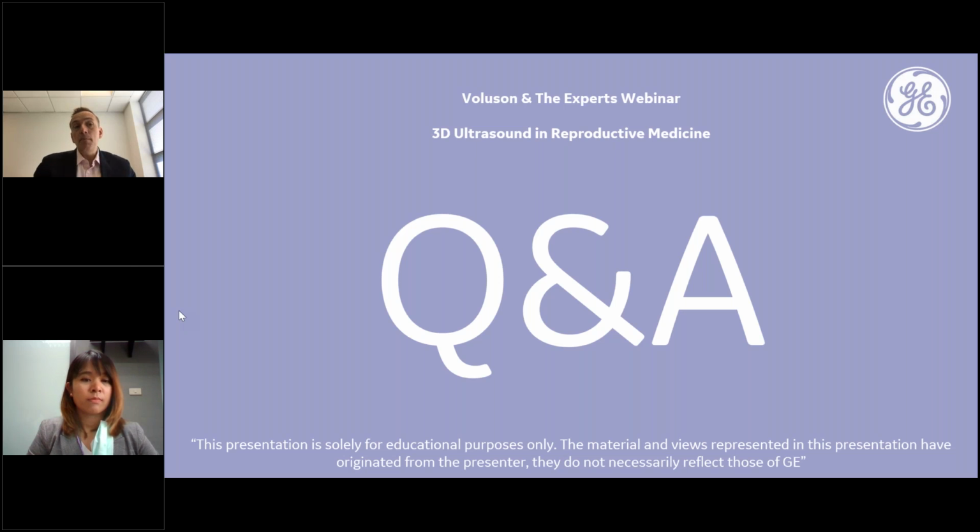So I would recommend you look back at some of the data from the 80s and 90s on pattern. There are some really good studies. We know the endometrium adopts a triple pattern, and then it becomes homogeneous and goes through an intermediate phase. That's all to do with estrogen and the transference over to progesterone dominance. So if your endometrium maintains a triple pattern, that's detrimental. And if it becomes homogeneous too soon, that's detrimental, because you've got to have the right estrogen-progesterone ratio and change to make it receptive. That's the concept of the ERA study, the endometrial biopsy and the genetic assessment. So the endometrium has a genetic receptivity picture.